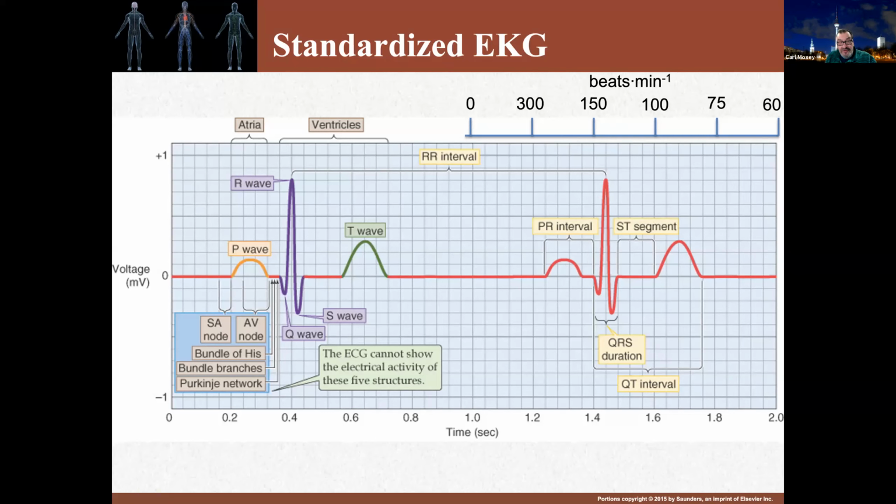And again, this is a very important part of the EKG tracing. The lack of a PR interval could indicate that both the atria and the ventricles are contracting simultaneously. The simultaneous contraction would obviously hamper smooth blood flow and could lead to numerous cardiac conditions, complications. This interval is a measure of the lag between the P wave and the QRS complex.